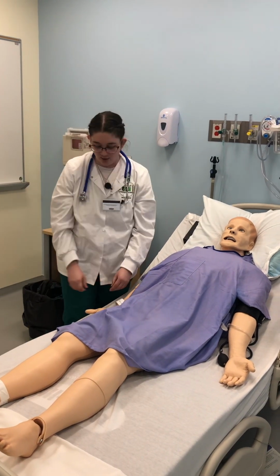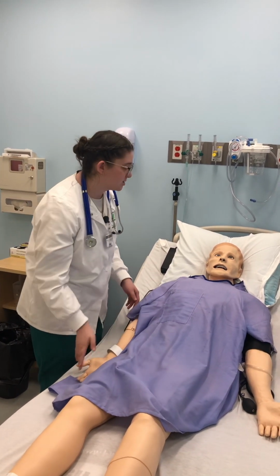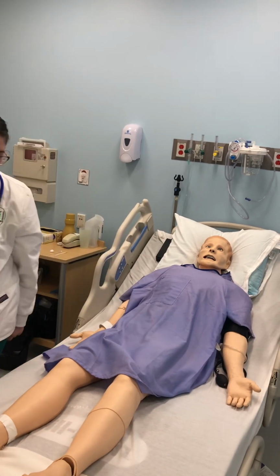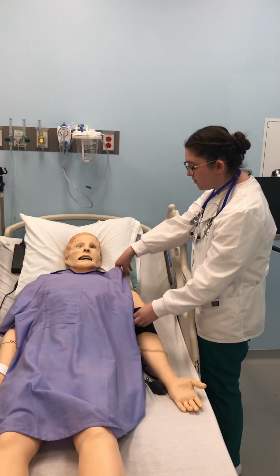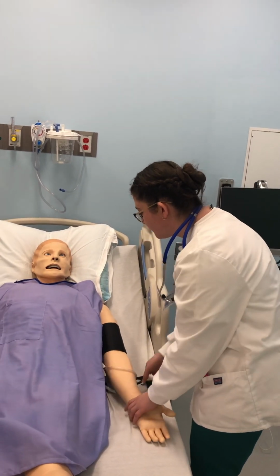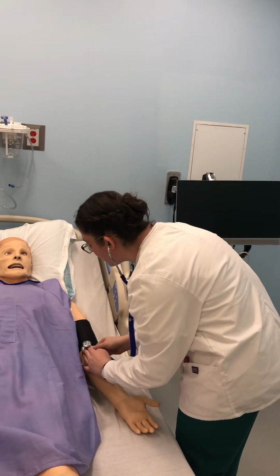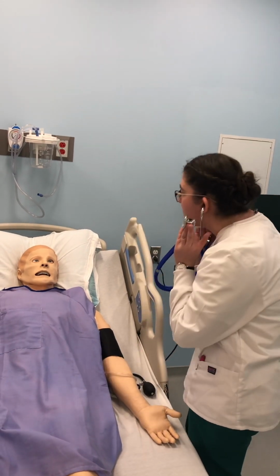Next, I'm going to check my patient's O2 level on their pulse ox, and it was at 98% on room air, which is good. Normal range is 95 to 100. Next, I'm going to do the blood pressure, which is located on his other arm. And I'm going to place the cuff on his upper arm. I'm going to locate the brachial artery, which is on the inner part of their arm, and I'm going to pump the cuff up. And I'll be listening for a systolic and diastolic value. I'm going to place the stethoscope on their brachial artery. I'm going to pump the cuff. And it was at 120/80, which is a perfect blood pressure.